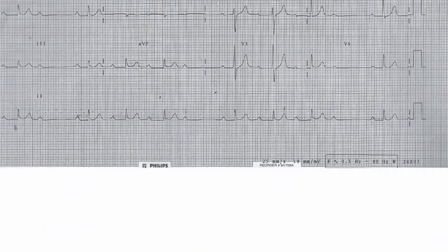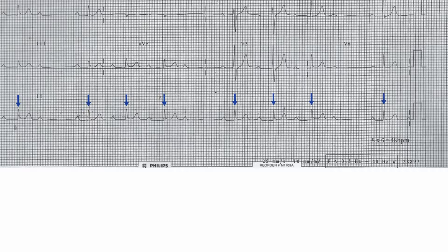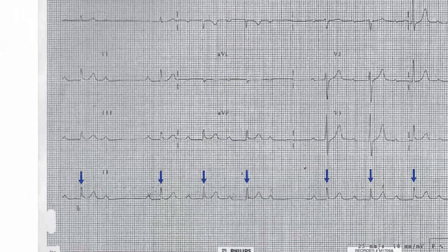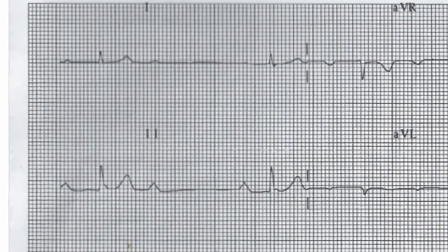The heart rate is 48 beats per minute and the rhythm is clearly irregular. The axis is normal with an upright complex in lead 1 and an upright complex in lead 2.